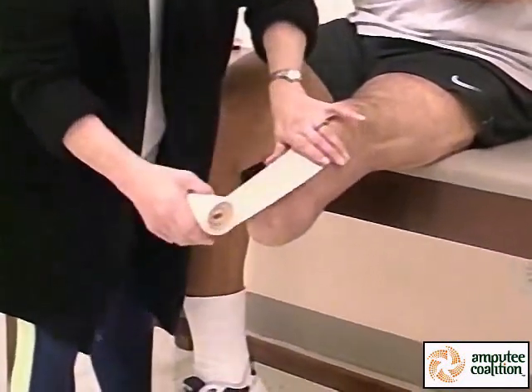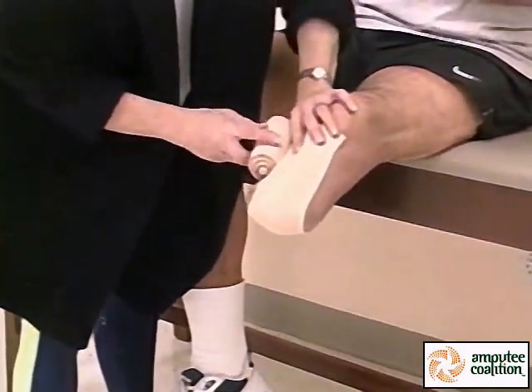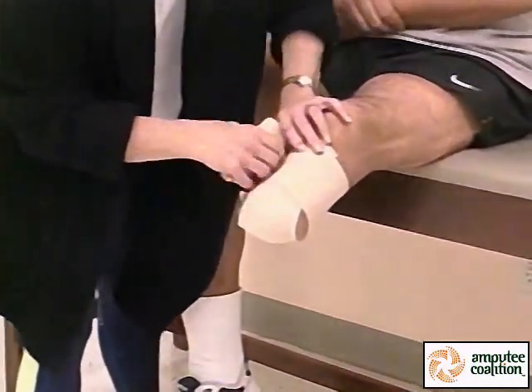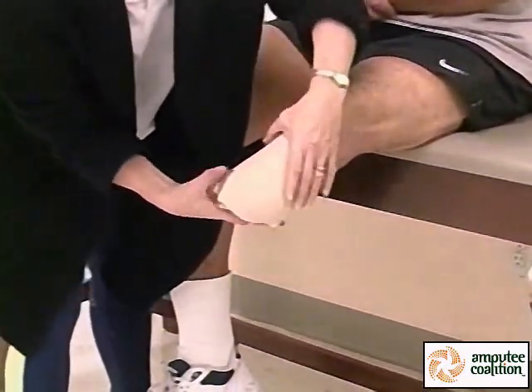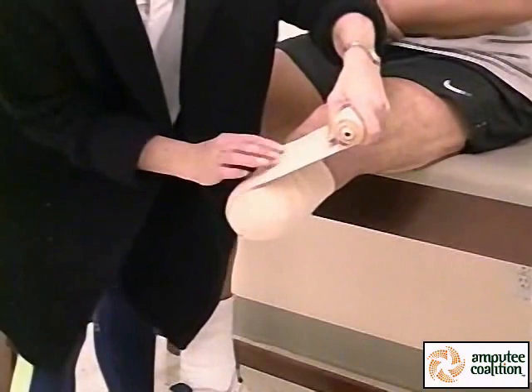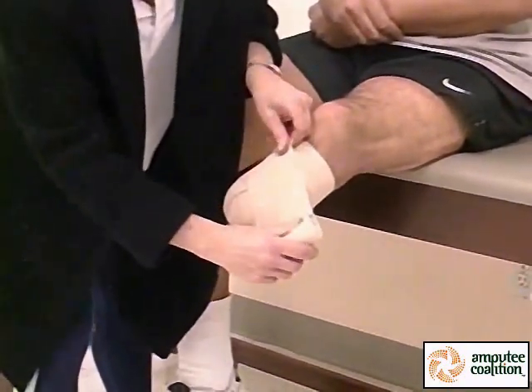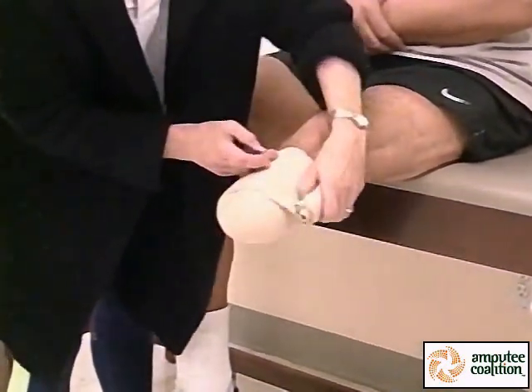Using a four-inch bandage, first put a stretch in the bandage and go over the end of the limb. Release the stretch a little and wrap once around to secure the bandage. Putting stretch back into the bandage, go slightly to one side of center, round the back, and over the other side of center. Continue in this figure-of-eight fashion until you've completely covered the distal end of the limb.